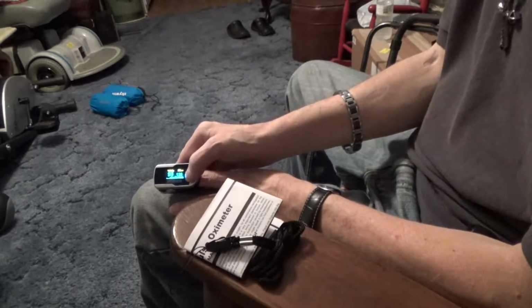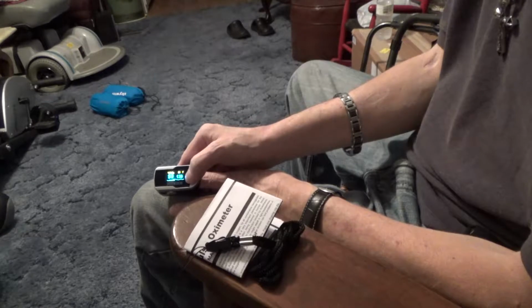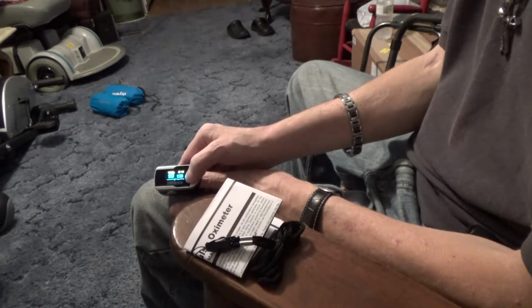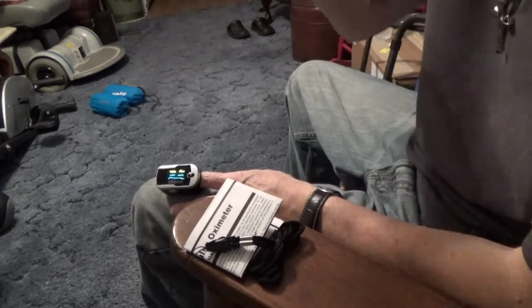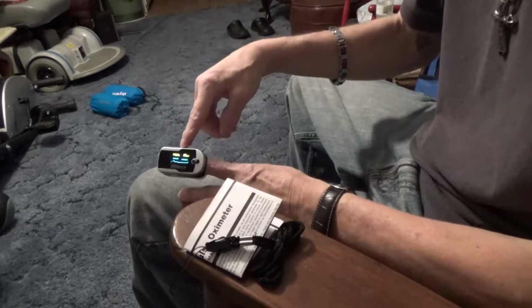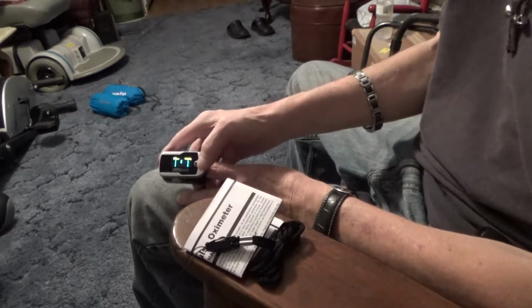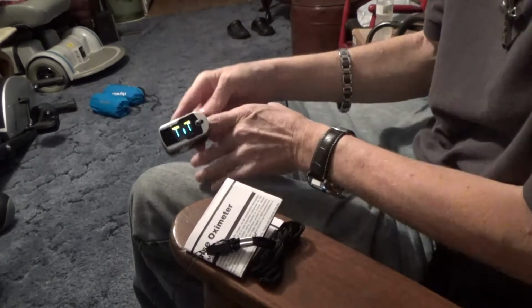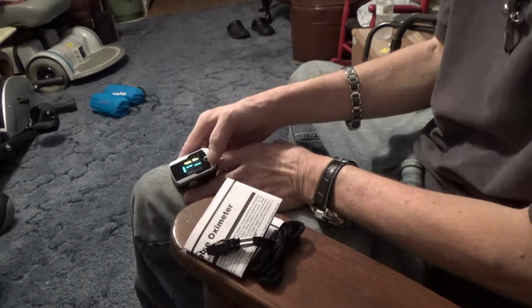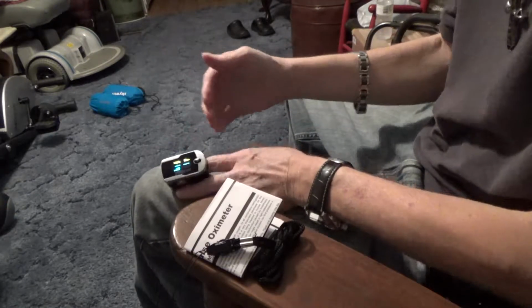Again, if I hold this down, the brightness cycles through. I don't know how well you could actually see the brightness. It's in a bright room and you can actually see this quite well. I don't know if you can see it, but I can see it quite well. And if I push the button, I can flip between different angles. So if I'm holding it this way or this way, depending on what finger I'm holding it on, I can read it and see the different meter and layouts.